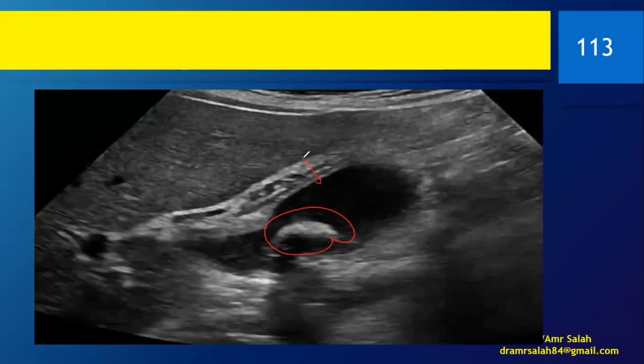I have here the gallbladder wall thickening, I have the stone, I have my clinical picture with the patient suffering, I have a positive sonographic Murphy sign. I would say that this is acute cholecystitis. If the patient doesn't have a suggestive clinical picture or positive Murphy sign, and he only has this gallbladder stone and the gallbladder wall thickening and other causes that would explain it, I wouldn't say acute calculous cholecystitis. I would say that there is a stone and there is diffuse gallbladder wall thickening. So it's important to be precise, and that you gather the data and accordingly suggest your diagnosis.